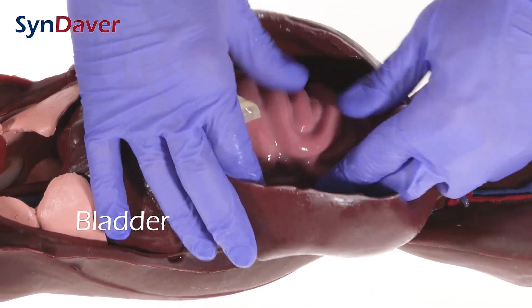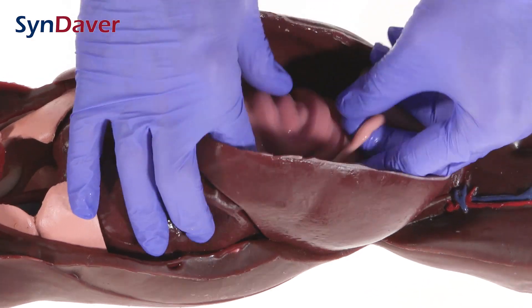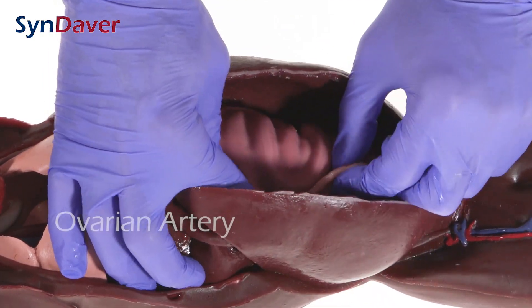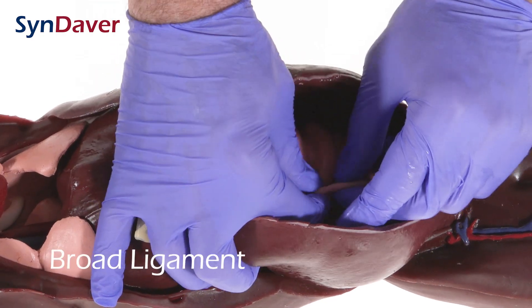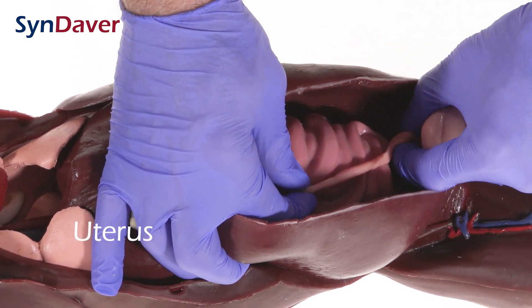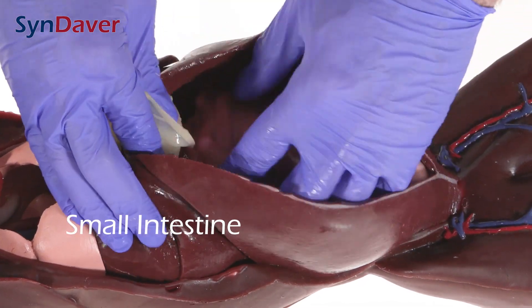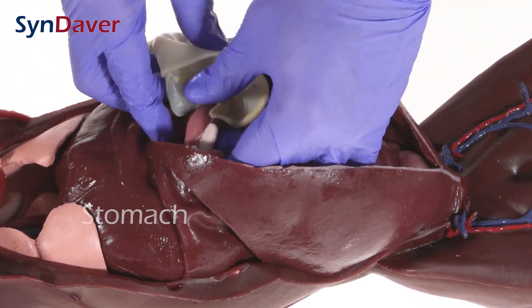We also have the bladder. We have the reproductive tract — again, this is a female — so we have the ovarian artery, the suspensory ligament, broad ligament, and the body of the uterus. We have the intestines — these are small intestines — and the stomach, which I can remove.